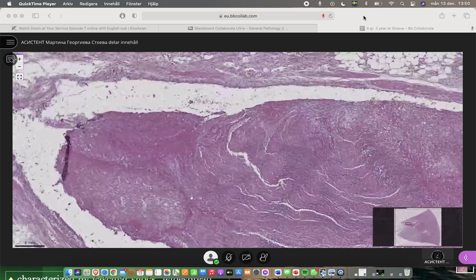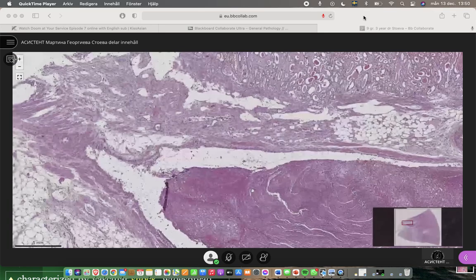But here this thrombus or embolus has nothing to do with the amyloidosis, and it's not caused by the amyloidosis, but it's just an additional finding. That's why I'm telling you not to mention it from the very beginning, but only if you're asked.